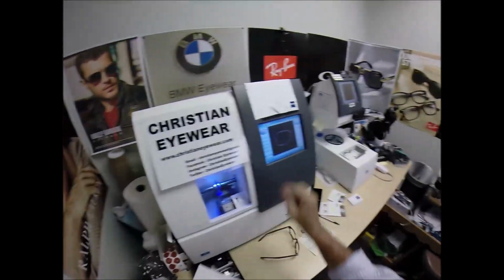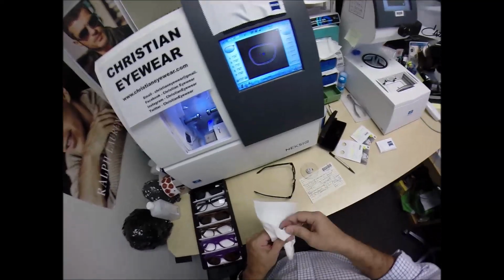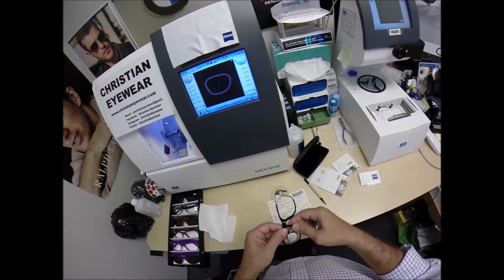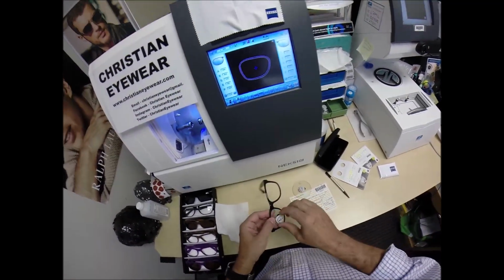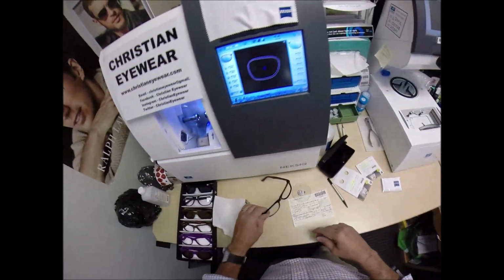So let's see if the lens fits this time. Take it out of the clamp, the chuck. Tuck it in at the outside corners first. Using my thumbs, press down with the nose, it snaps right in. The block practically comes off. Dry that off, add that to my sticker collection.